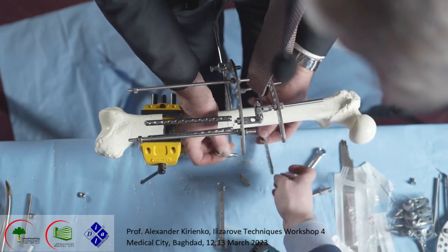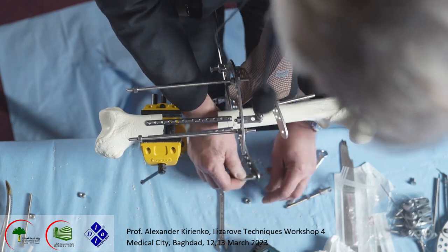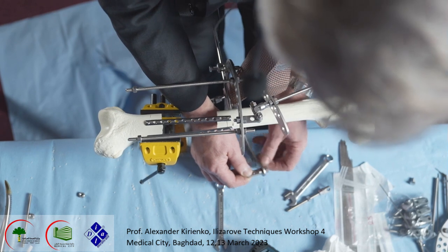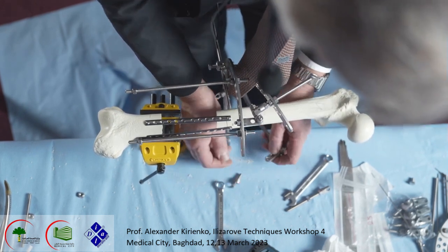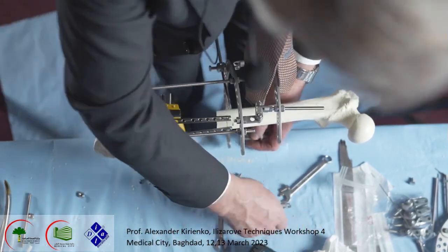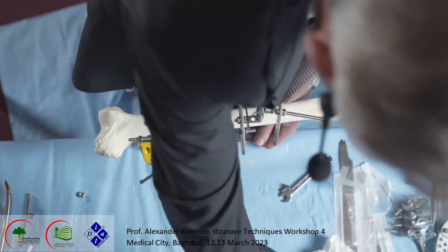And what I do here, I do post proximal. And I put the rod here, in the same hole.